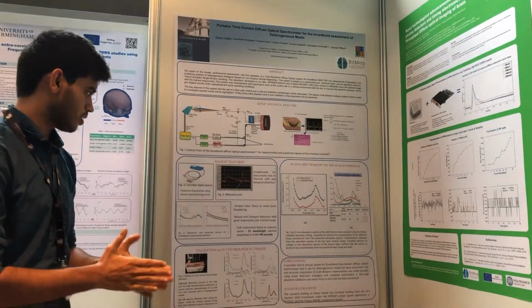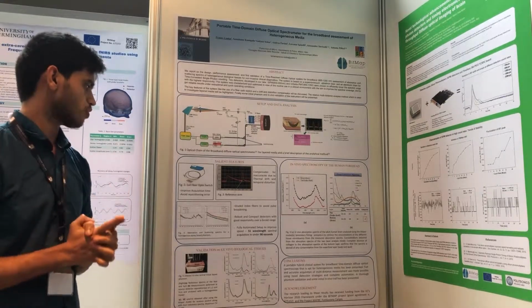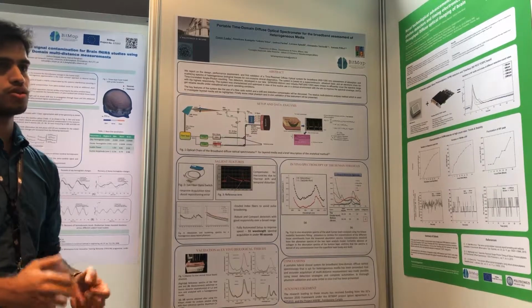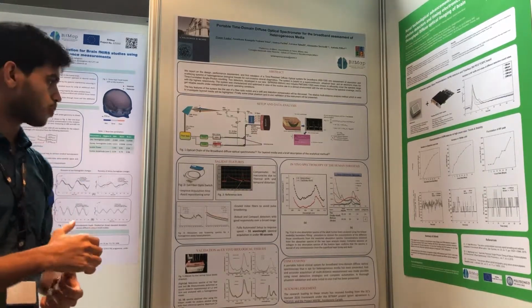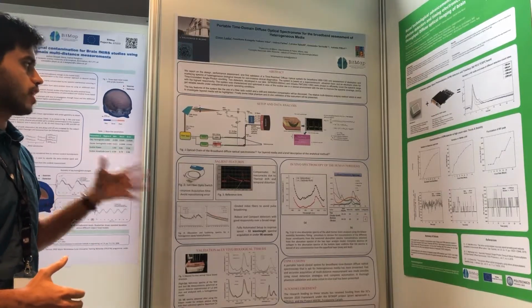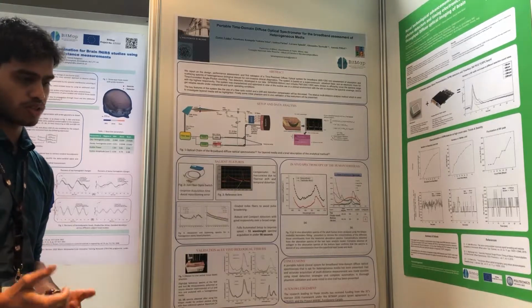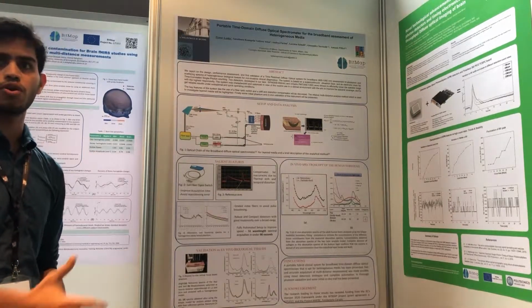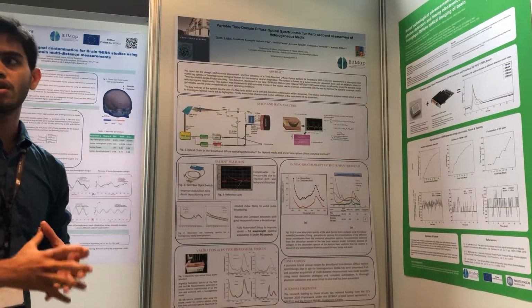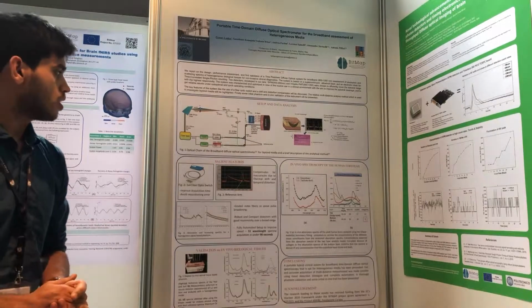So firstly, some interesting features. Firstly, the use of a fiber optic switch. Though this switch leads to a little reduction in the input power, it's a very important piece of equipment in this particular system, because firstly it reduces the acquisition time due to automation, and more importantly it avoids the repositioning error, which is a very huge problem, especially in clinical scenarios.